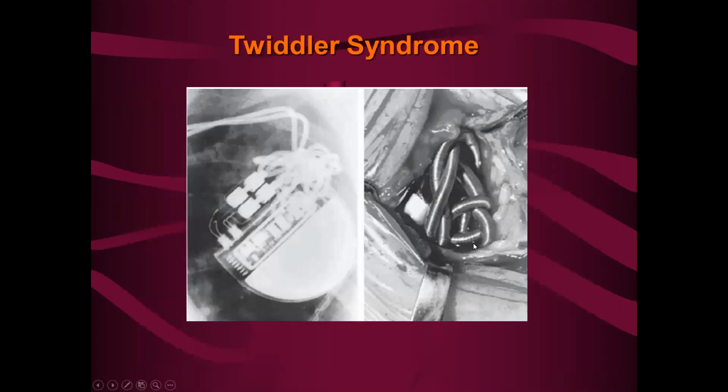There's something called Twiddler syndrome, and that's why we also want to avoid this kind of complication. When patients have this unconscious habit of just, because there's something in their chest, they just have this unconscious effort to keep touching it and rotating it.